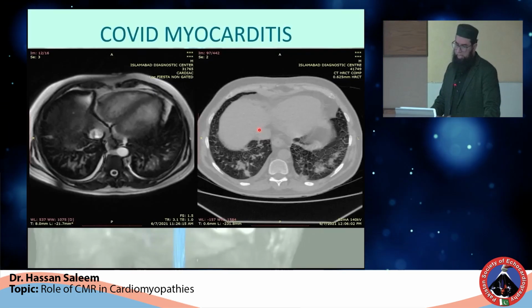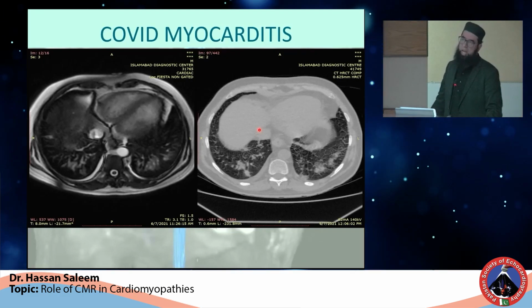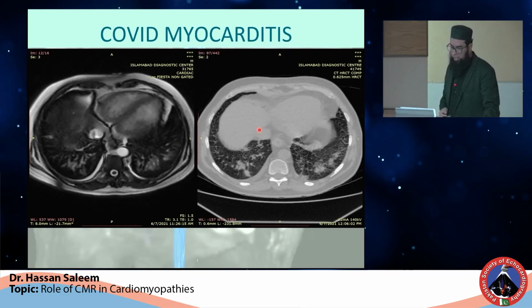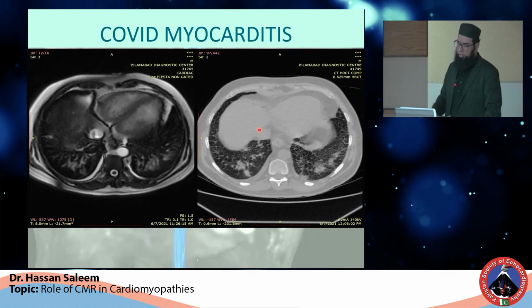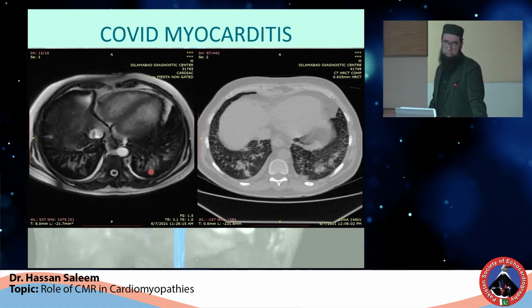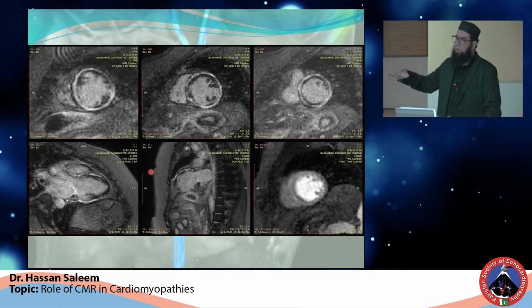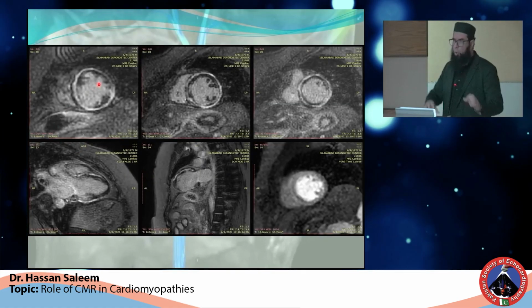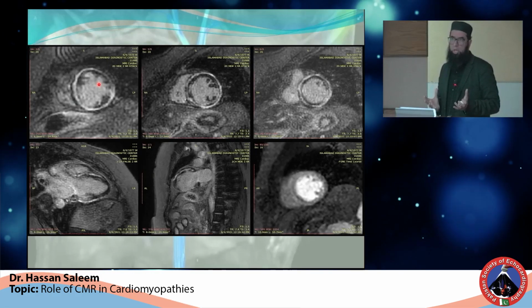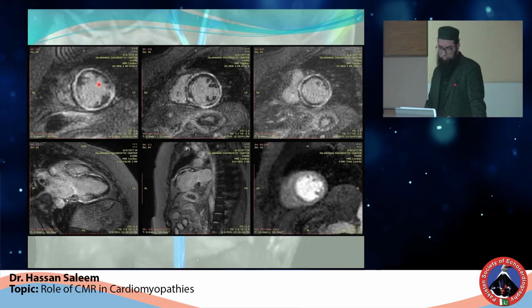Then myocarditis. There's a young fellow, again an unfortunate patient, who flew all the way from Karachi and had big patches of COVID myocarditis, still observable on the imaging. It was a young family traveling with small kids. Imagine, the whole myocardium is almost scarred. The EF was really down, I think around 15% or so.